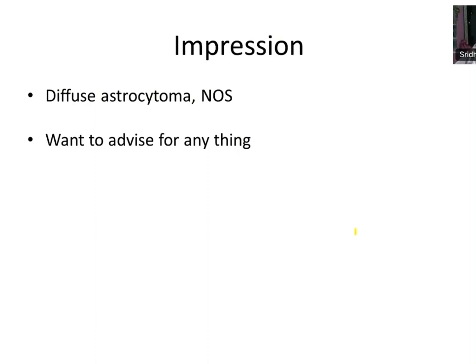If you had got a classic case of grade 4 with microvascular proliferation and necrosis, probably ATRX retained, there is no need to go further. You might use it as a grade 4 tumor. But here you have not got histologically grade 4 features. Yes sir, you got grade 3 type of features. Can we call it grade 4?